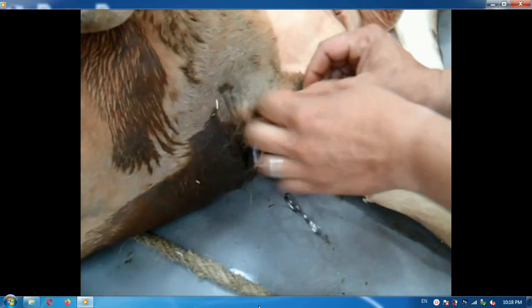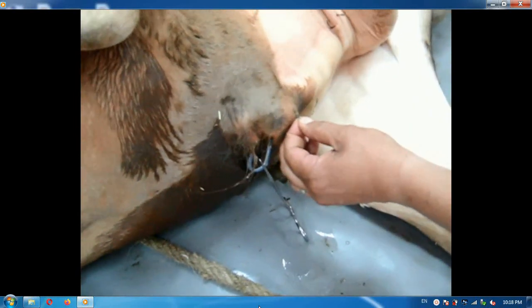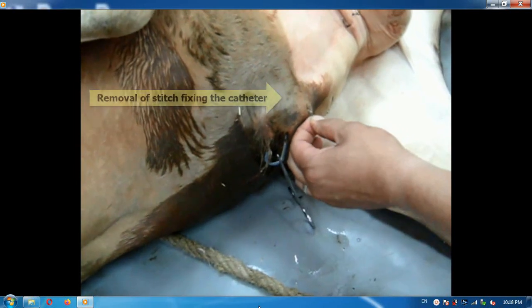This is the catheter that was used. It is fixed at the previous site and secured to the external urethral orifice.